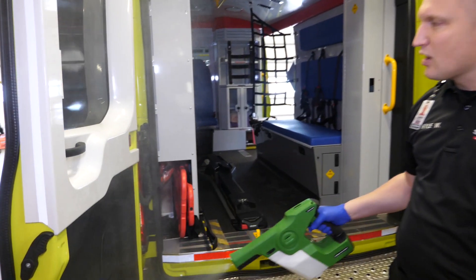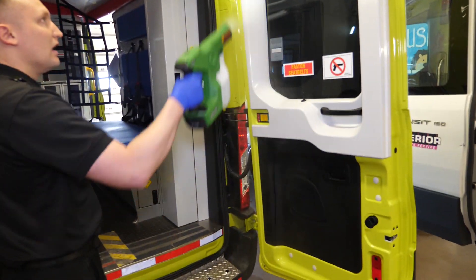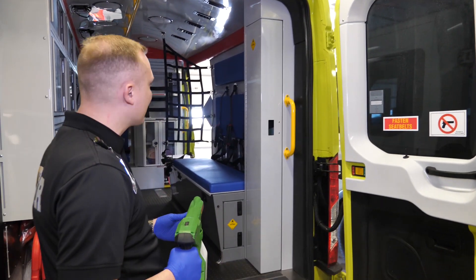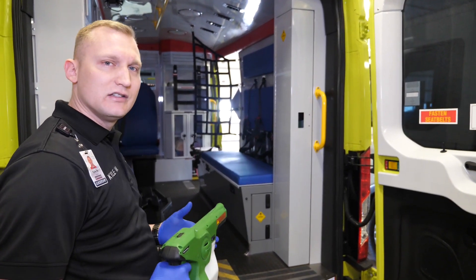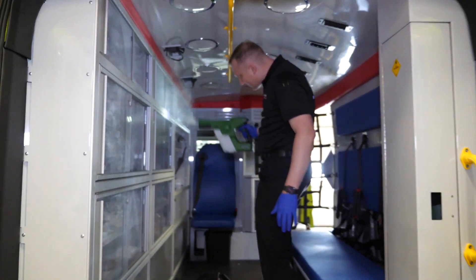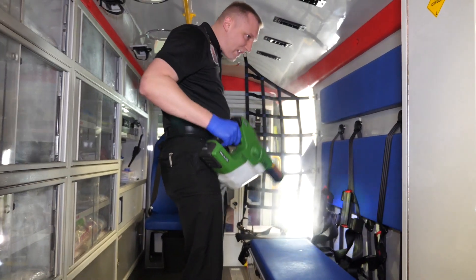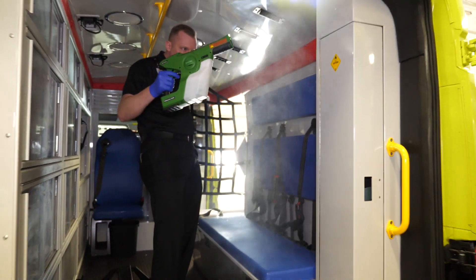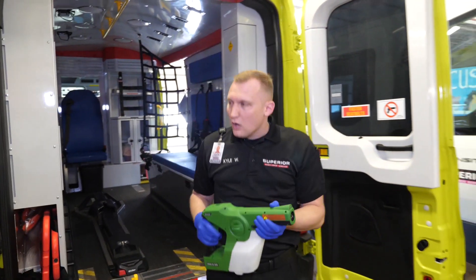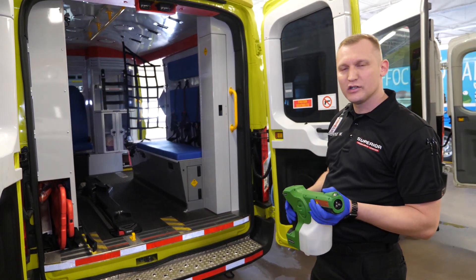We start by using the same process to spray the entire surface of the back of the vehicle. Note that this is a demonstration, so I may not get the entire back of the vehicle — you want to make sure you cover it entirely. We spray down the entire back, ensuring that all surfaces are wet for two minutes for that decontamination to process. Don't forget your ceiling. Don't forget your floor. We allow this unit to air dry, and then the back and front of the unit are decontaminated.